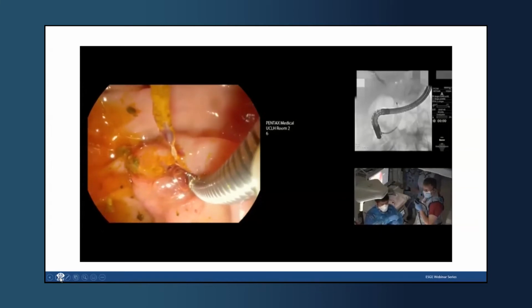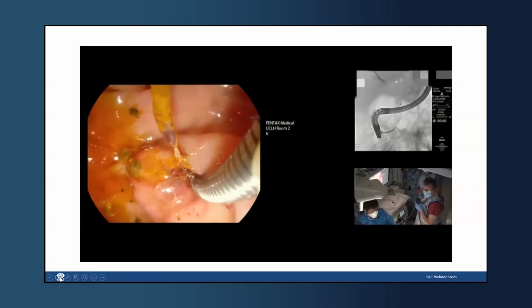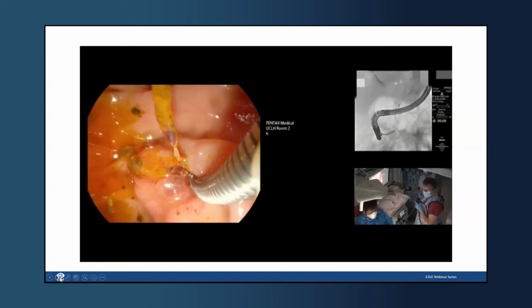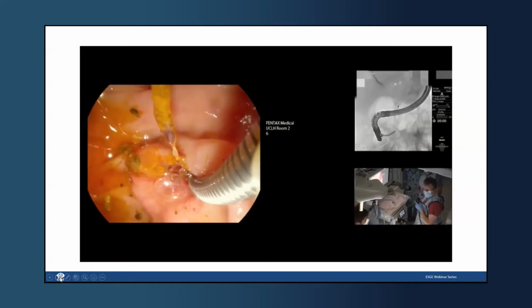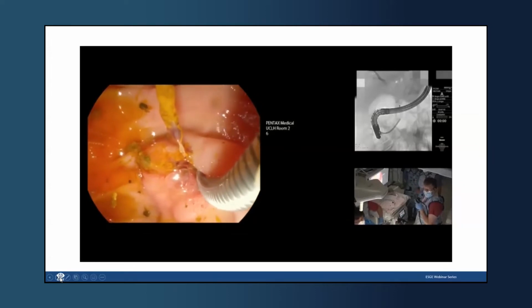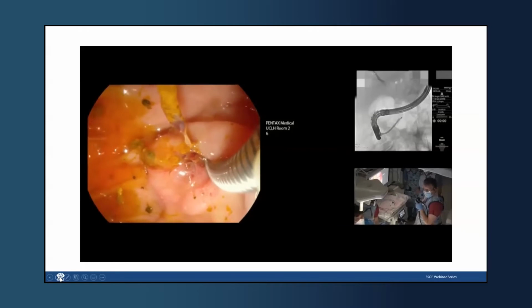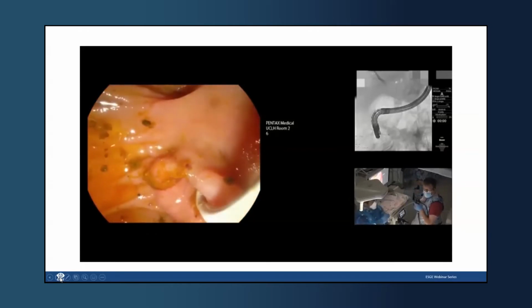Very good, keep going. Okay, good. Right, now you can close the ratchet up on this. Yeah. And now screen, please. Keep screening. Yeah, and we crush in the middle of the duct. Yeah, keep going. Okay, good. Lovely. Screen.